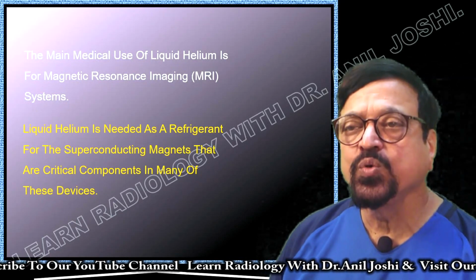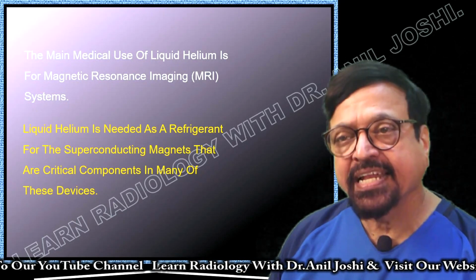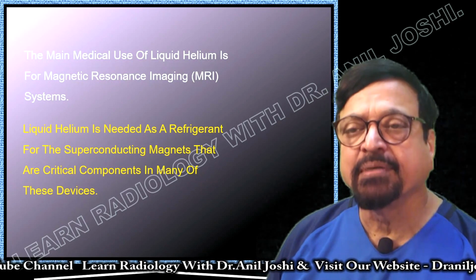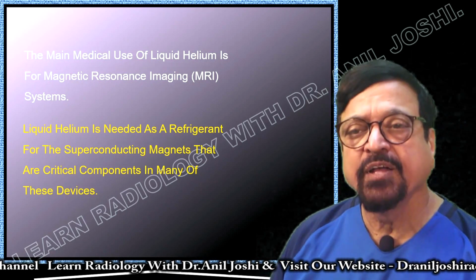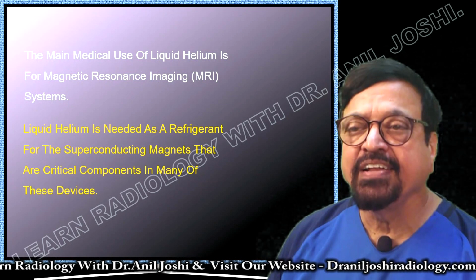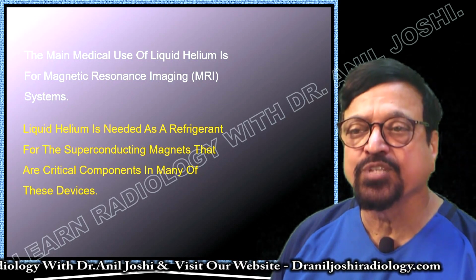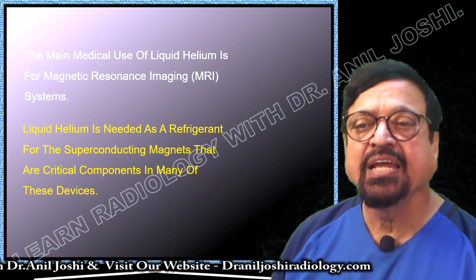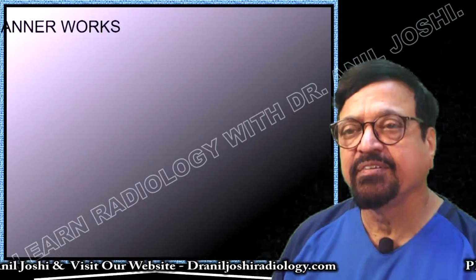The main medical use of liquid helium is for magnetic resonance imaging systems. We are using helium, but is it the only place where it is used? The answer is no. There are a lot of other uses of helium also. Liquid helium is needed as a refrigerant for the superconducting magnets that are a critical component in many devices.